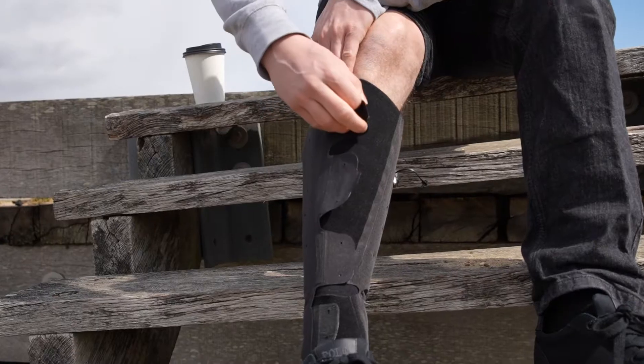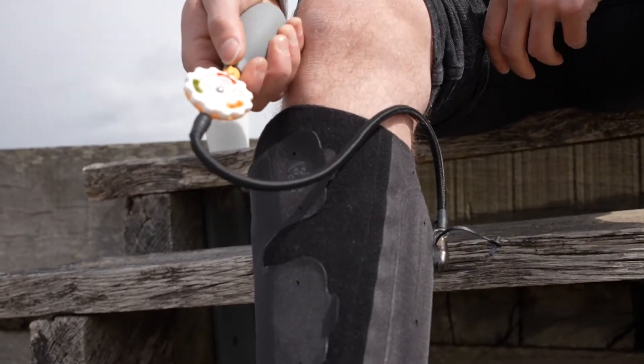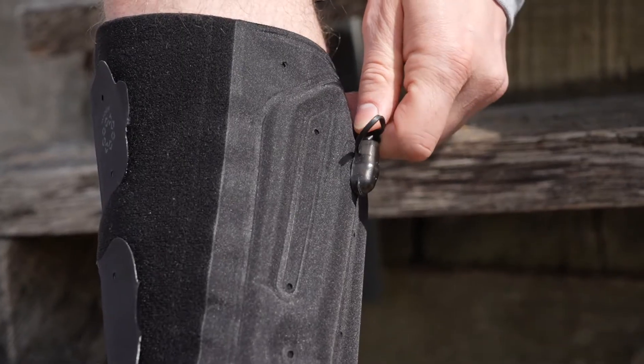AeroWrap is an easier, more comfortable way to effectively manage chronic leg swelling, bringing the best in next-generation compression technology.